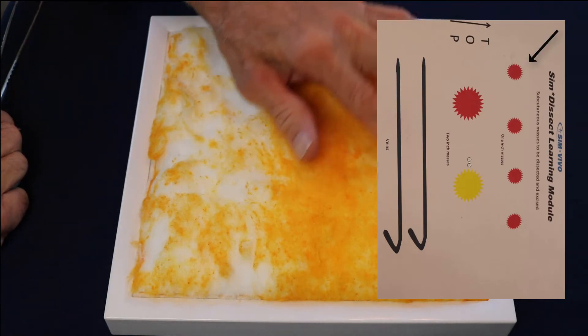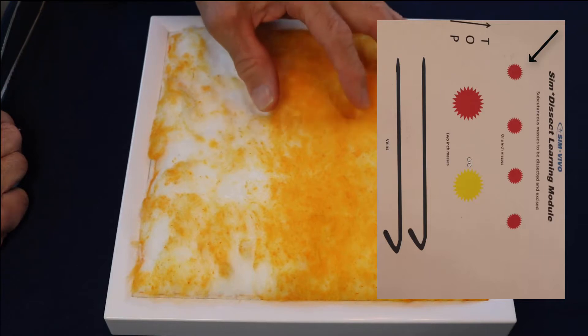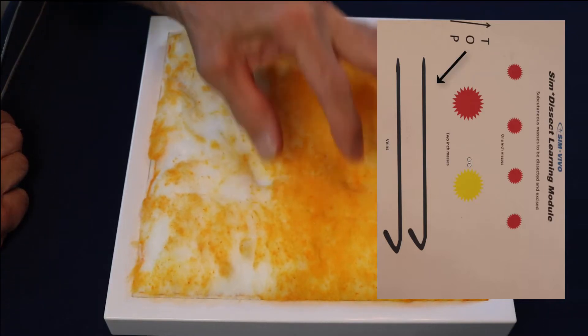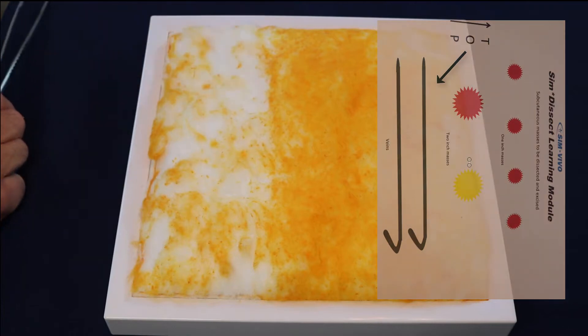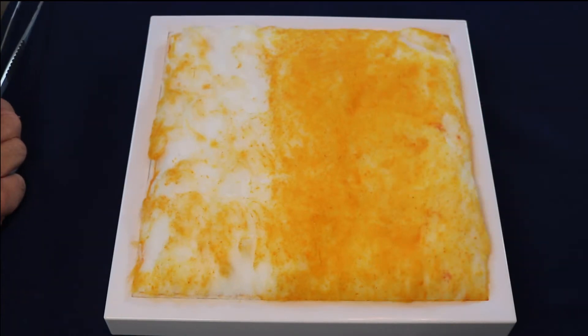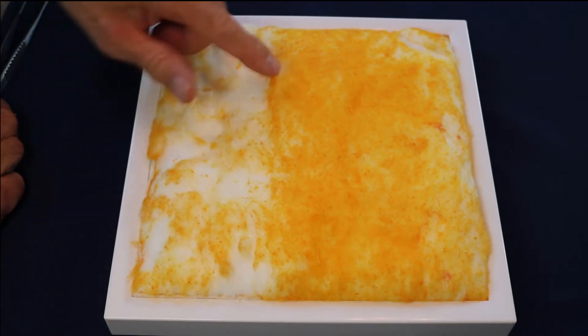Across the top are four small masses placed side by side. In the middle are two larger masses, and across the bottom lie two blue tubes that represent veins. You will not be able to palpate the veins and locating them will require some exploration.